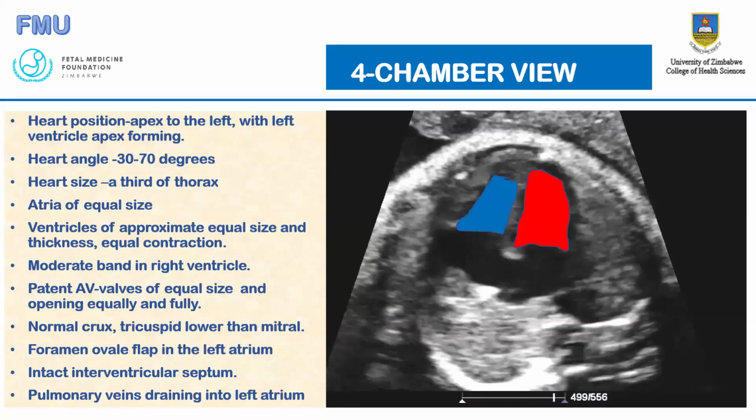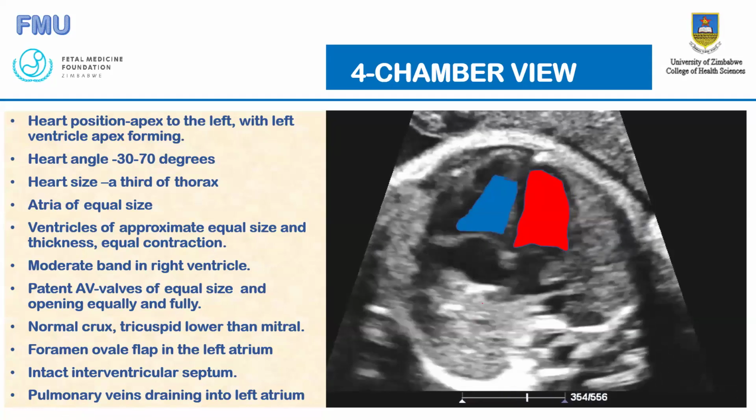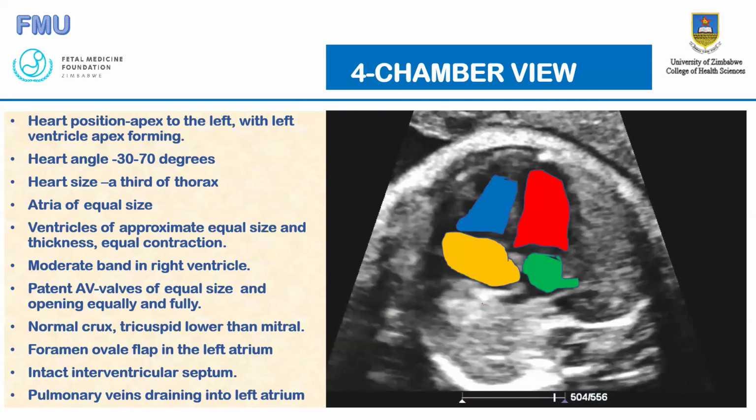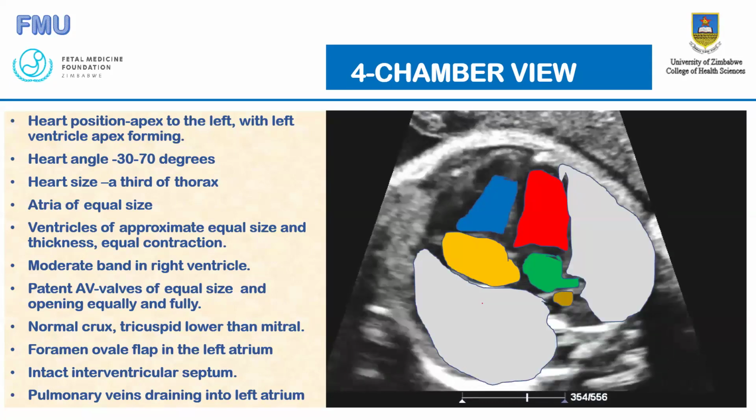So just to demonstrate: that's the right ventricle, left ventricle, right atrium, left atrium, the aorta, and these are the lungs. You see there.